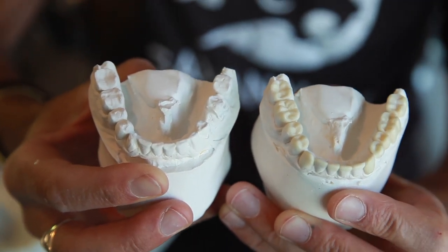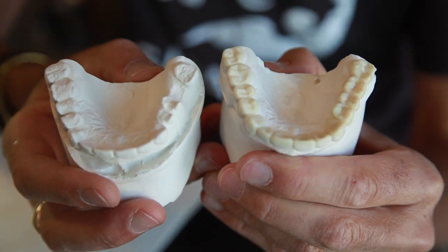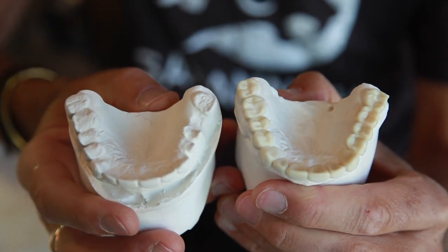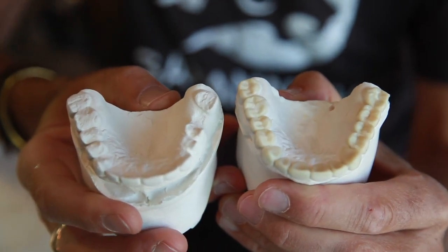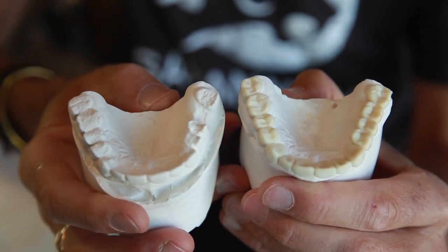That's the lower arch done and here's the upper. This will all be done in composite material — temporary material — and this patient should function in a whole lot better way.